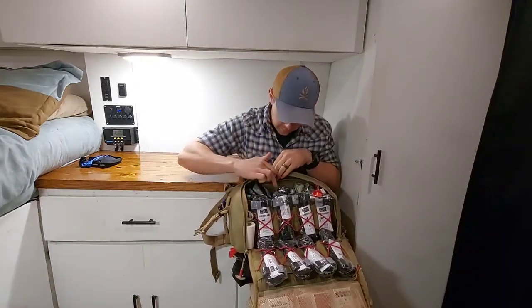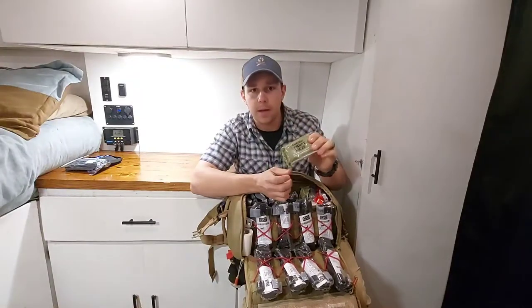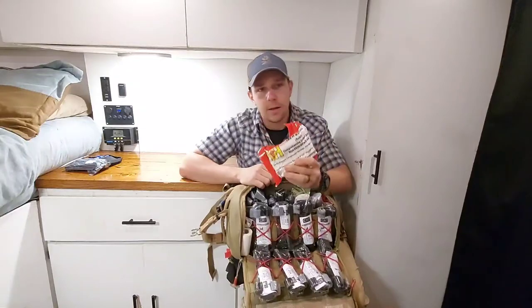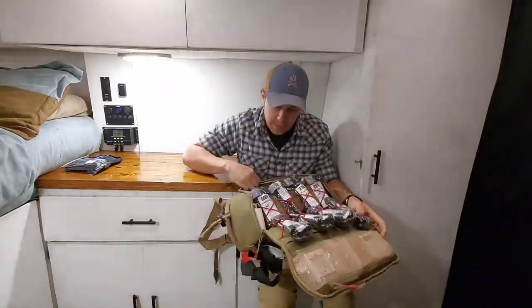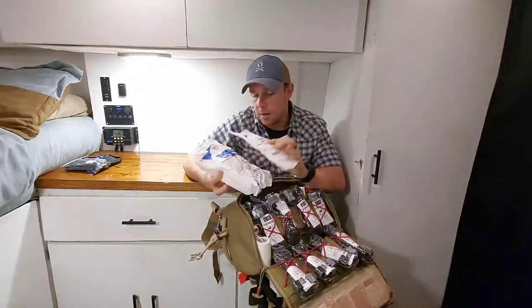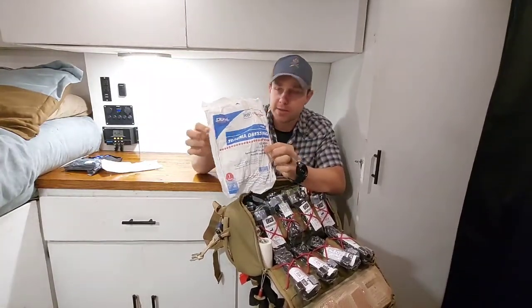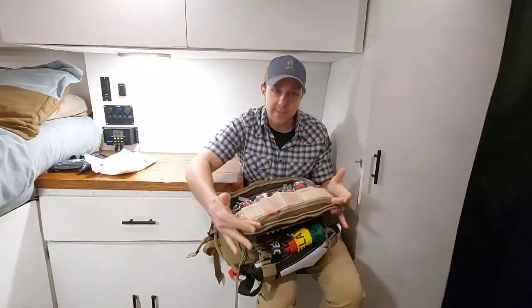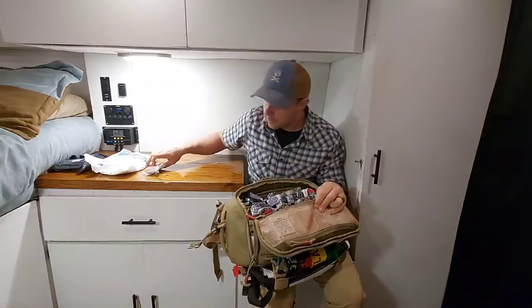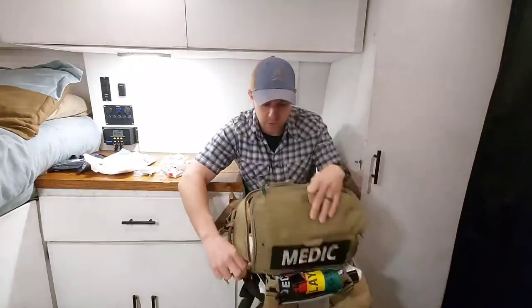We have six 6-inch Israeli bandages and some combat gauze — Quick Clot combat gauze with the hemostatic agent. We have three triangular bandages and then an 8x10 abdomen bandage, two of those. Back behind the tourniquets there's another compartment where I keep a few abdomen pads — an 8x10 ABD pad and a 10x30 trauma dressing. Down at the bottom there's a small mesh compartment where I keep all my gauze: HNH compressed gauze, eight or nine of those. And off to the side we have some trauma tape. That's my massive hemorrhage compartment.